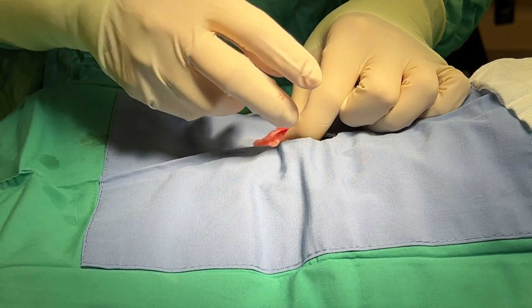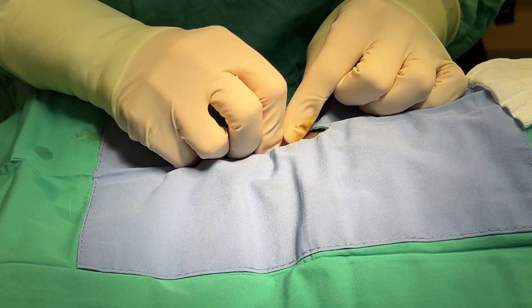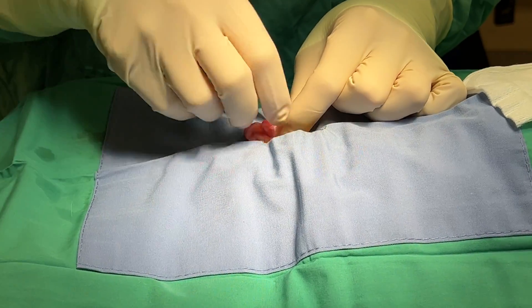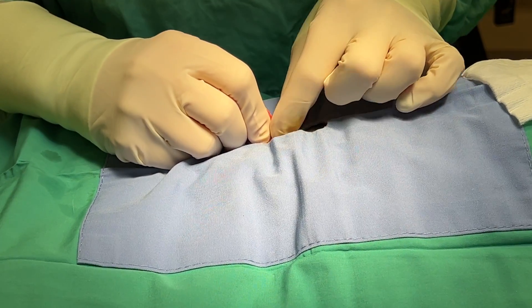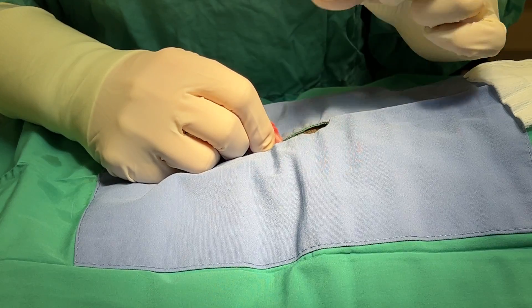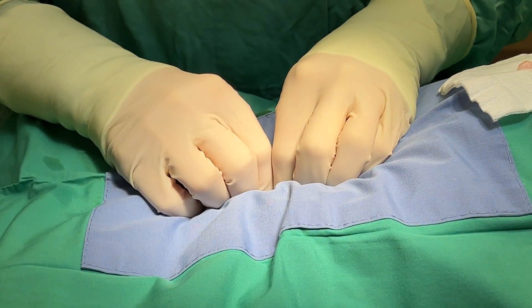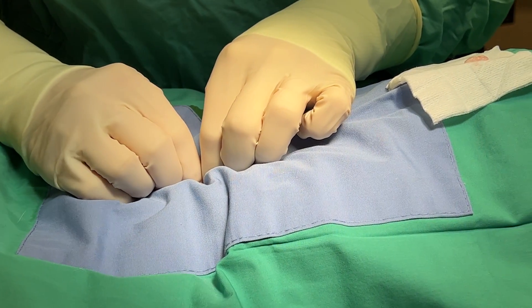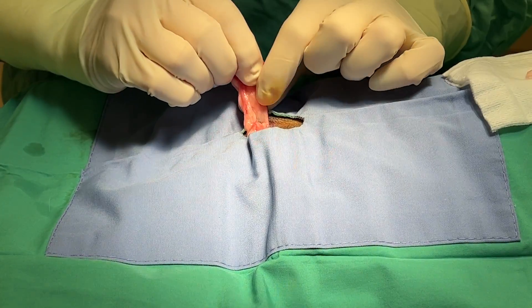I use a technique that I developed where I pinch the ovary with my right hand, my dominant hand, and then I use my left hand to pinch the suspensory. This hand is not doing anything — it's just feeling the suspensory. I pinch here, then I push against the dog firmly and move my hands calmly, slowly. This will either stretch or break the suspensory, and in this case it's stretched.